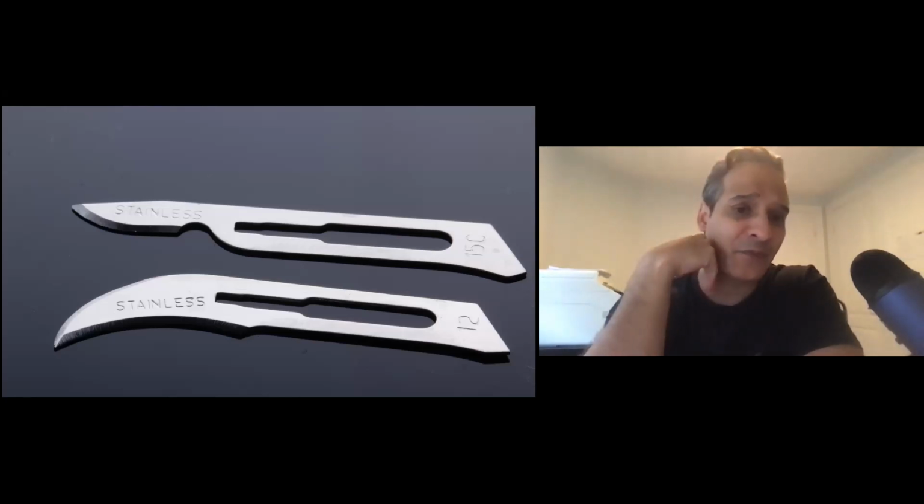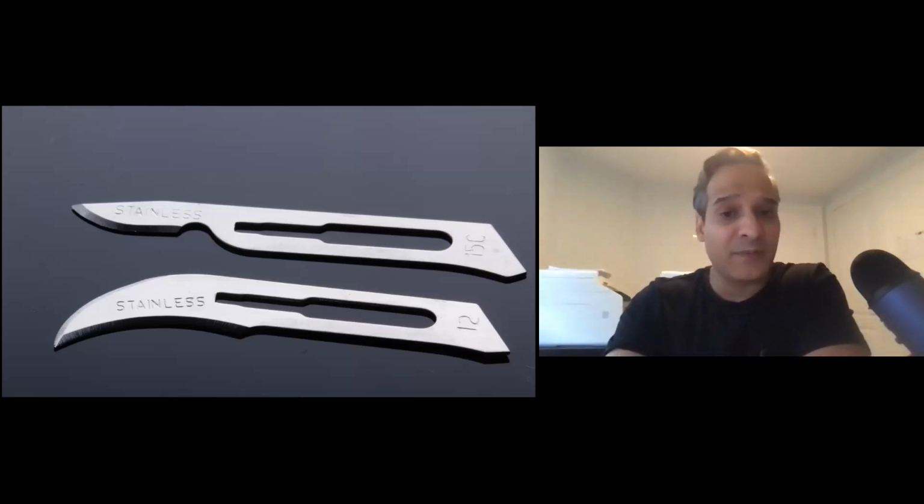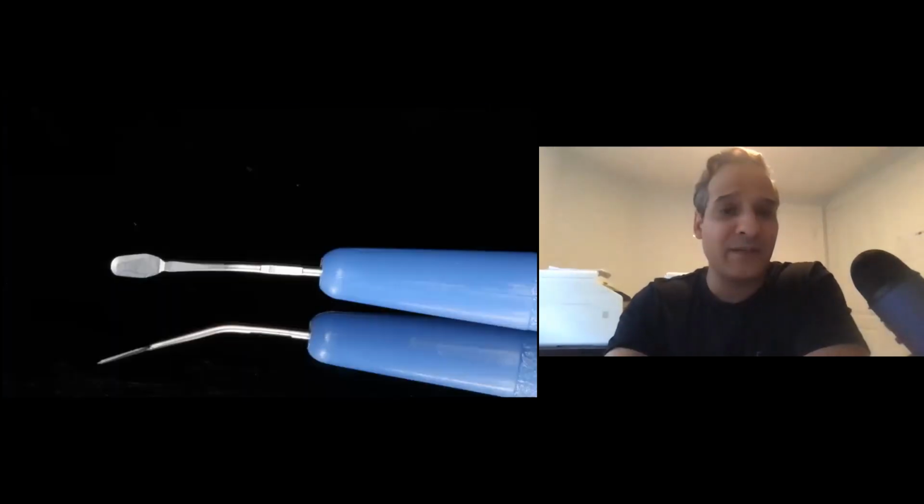And then sometimes for tuberosities, a 12B or 12. And then for working around the teeth, I like to use a 15C blade, sometimes a 12. Sometimes I use these micro blades. This is an ophthalmic blade that is very nice for making small little tunnels and small little incisions. It is very minimally invasive, but it's very sharp, and it worked really well for small areas.